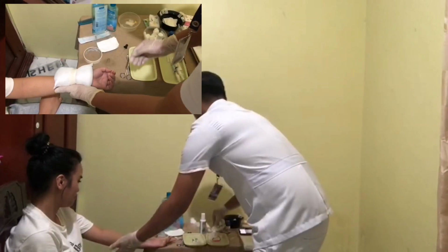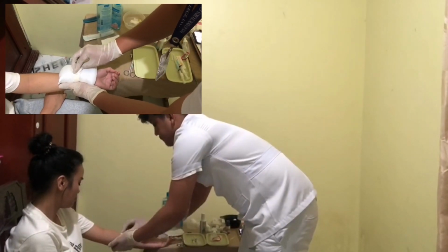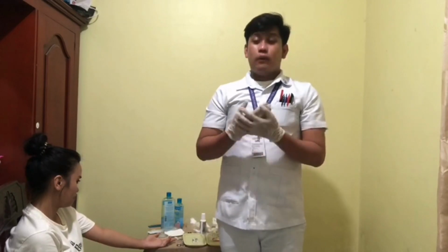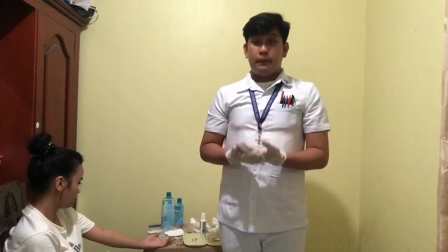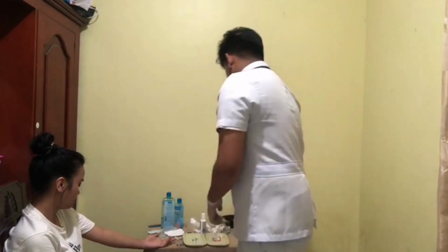So I am going to tap. And then we'll encircle the wheal with a pen. So this marked area with the wheal, we'll also instruct the patient not to rub the wheal or erase the mark. So after, we'll now do the procedure.